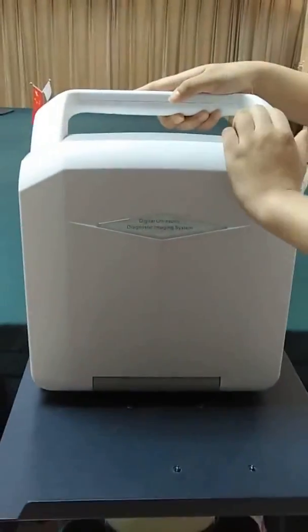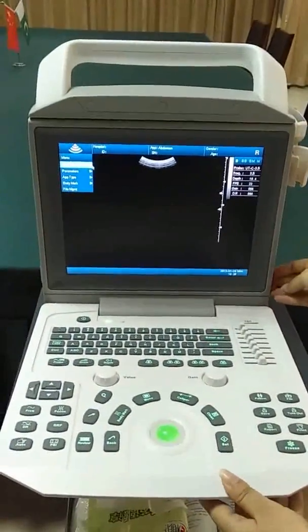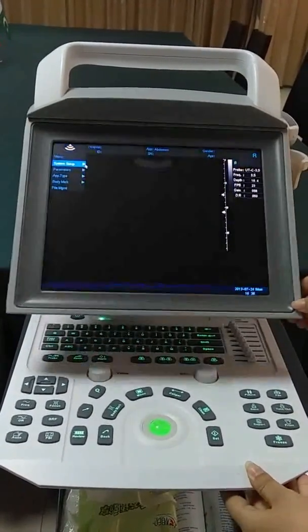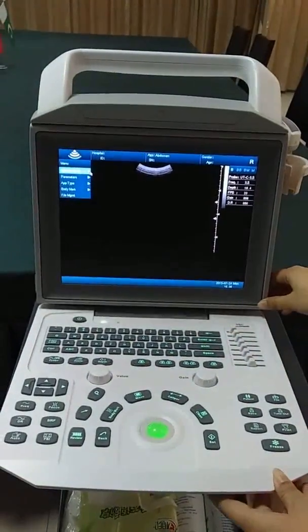We open it now. Here is a 12.1-inch LED screen. It is adjustable — the angle is 0 to 90 degrees.